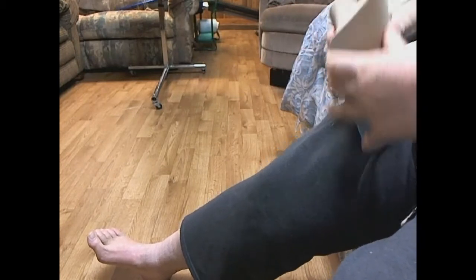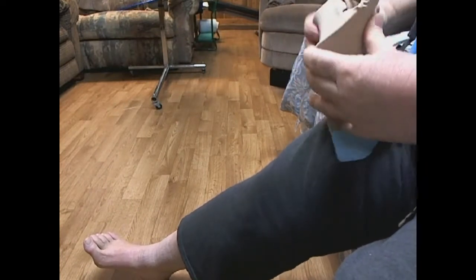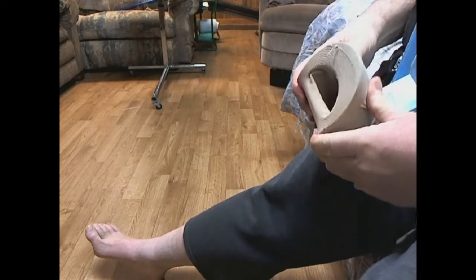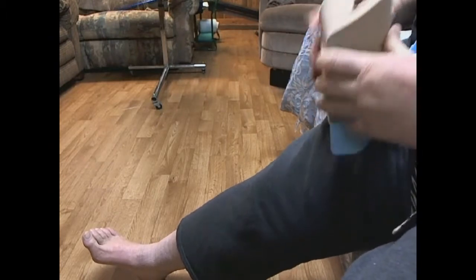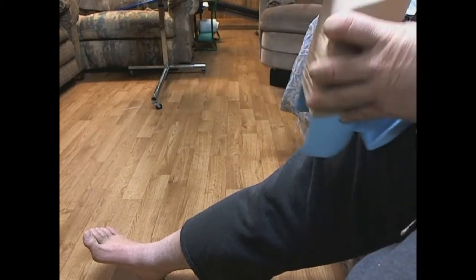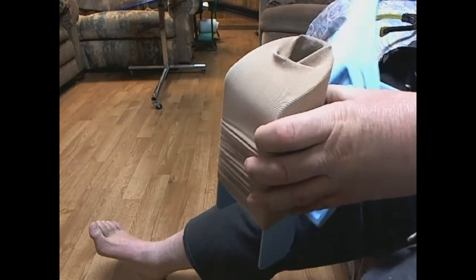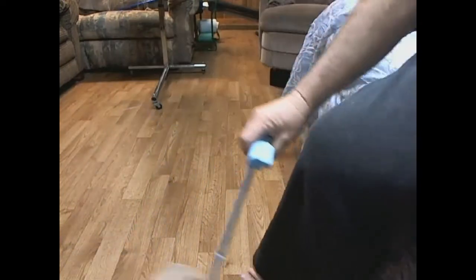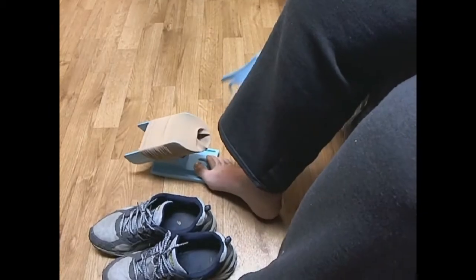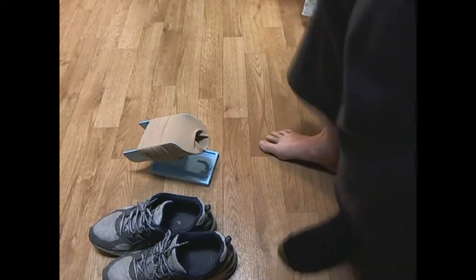and the trick on these is the heel. When you see the heel come up here, you want to make sure it's right at the bottom, and then you pull it further, a little further, a little further. I like to pull them almost all the way up so you can basically see the hole in the sock. Alright, so here's the trick with these. Okay. It's a little more difficult than the regular socks, but it does work.